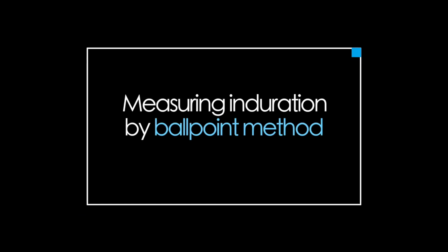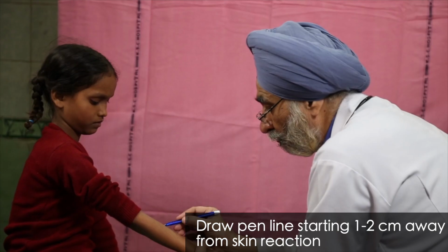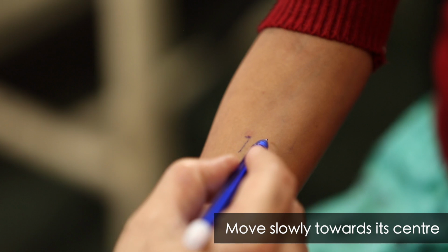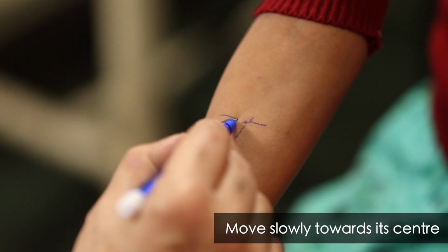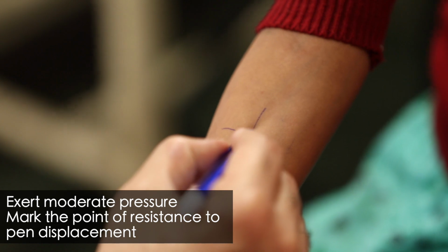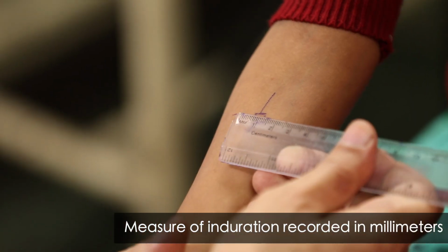Induration can also be measured by the ballpoint method. In this method, a ballpoint is brought from the edge of the arm towards the injection site, exerting moderate pressure against the skin till a resistance is felt due to the raised margin. The point where resistance to pen displacement occurs determines the outer limit of the induration. The width of the reaction is thus identified across the horizontal axis of the forearm.